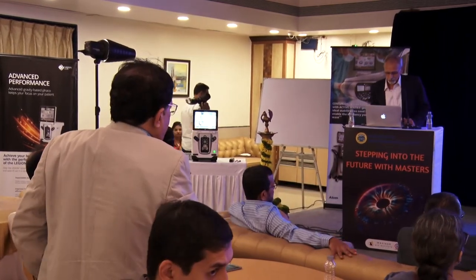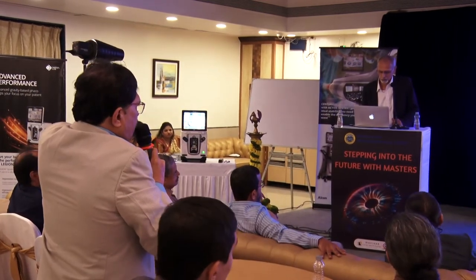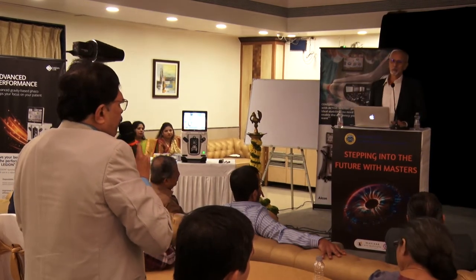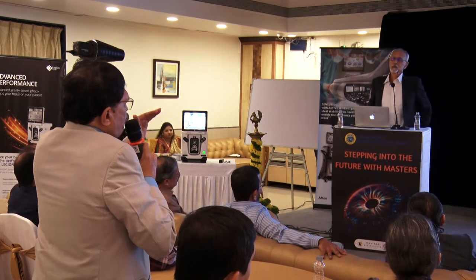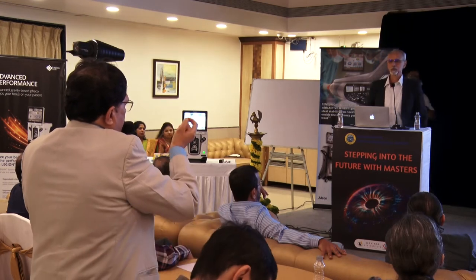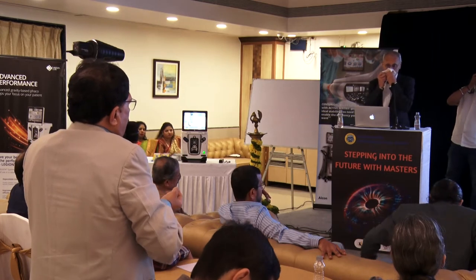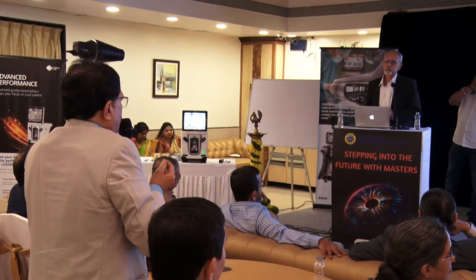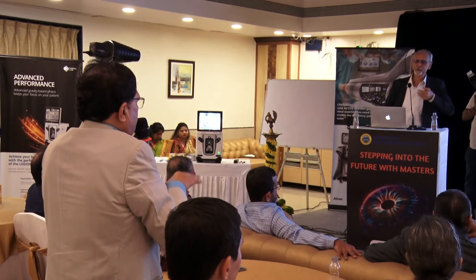To say or advise you anything, when you were pulling the posterior capsule, that is posterior plaque, I think if my left hand had put a continuous irrigation, that would have kept your posterior capsule a little deeper, and you would have had more holding of the plaque. You have done very well, but you would have saved the posterior capsule from getting torn up. That's what I feel. There would have been a pressure of irrigating fluid on the posterior capsule.